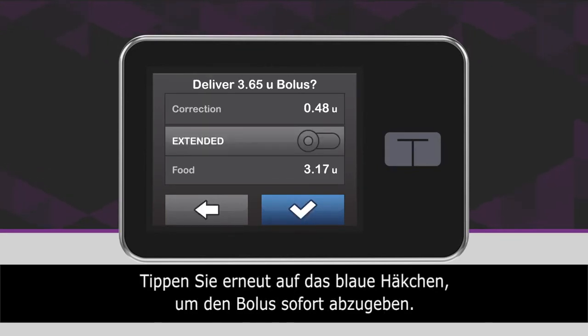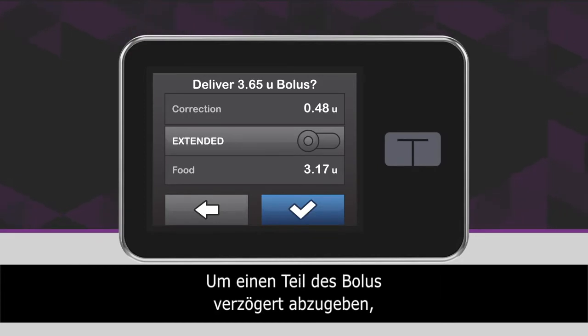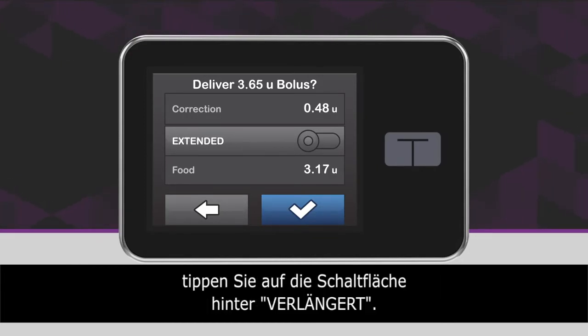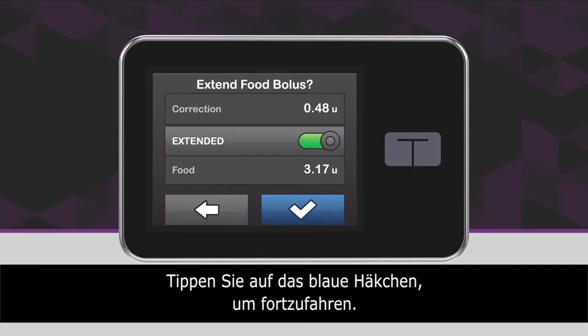Tap the blue checkmark icon to deliver the food bolus immediately. To deliver a portion of the food bolus over time, tap the toggle next to Extended to activate that feature. Tap the blue checkmark icon to continue.